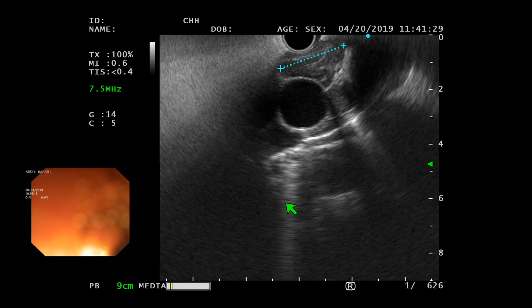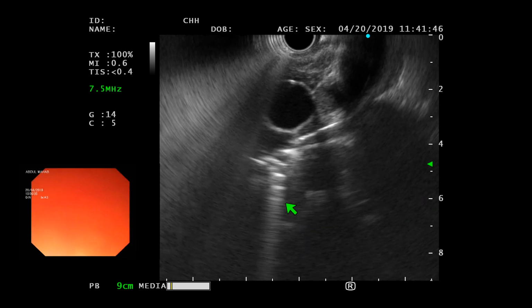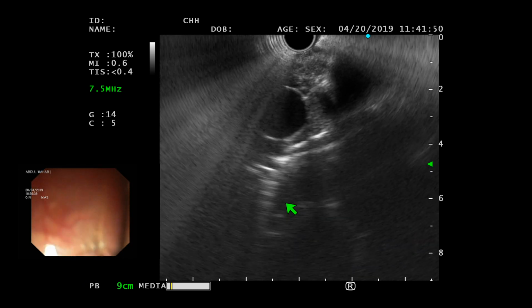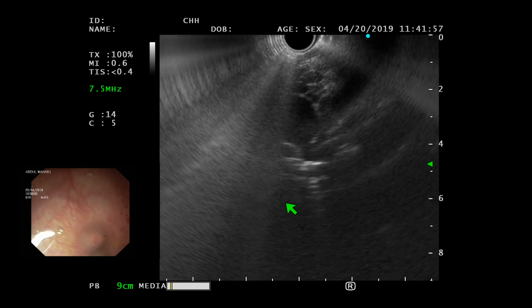I would biopsy from the carina because that's, or these, but look at the size. No, I agree. In my practice at least, even if it's for some other indication, with incidentally enlarged lymph nodes, especially over 15 millimeters, 20 millimeters, we will now sample. I'm a simple man. We were just discussing that yesterday. So we'll go.